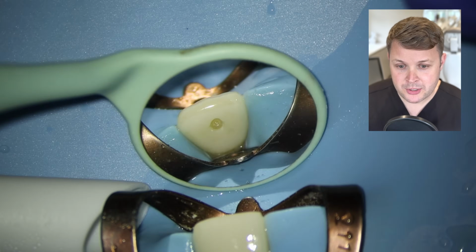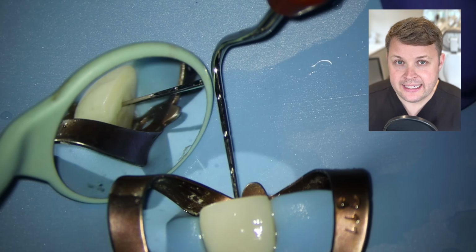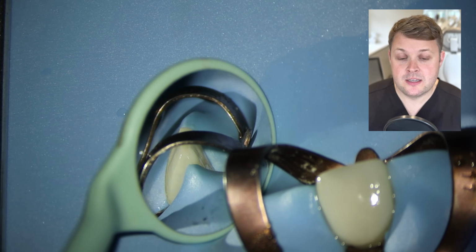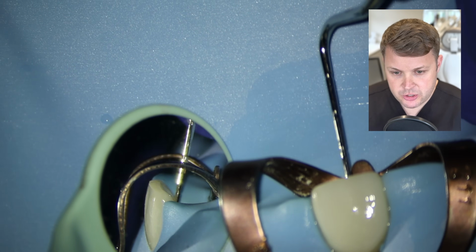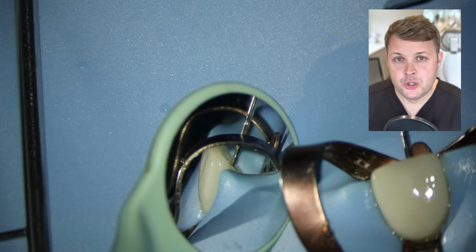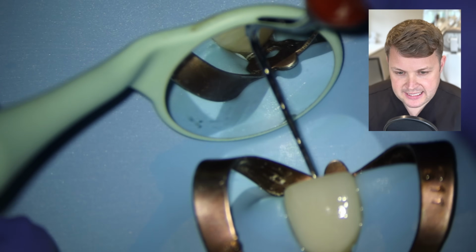I'm going to swap out my burr, and then I've noticed here that I am angulating my burr in the wrong direction. So if we draw a little bit of an arrow here, we can see that if we were to drill any further, this is going to go out of the tooth buccally. So what I need to do is adjust my angulation of my burr a little bit further palatally, and we can see that it looks a little bit better now.